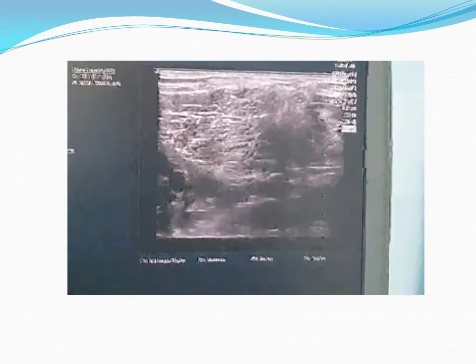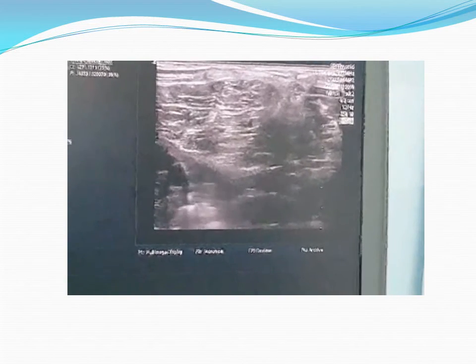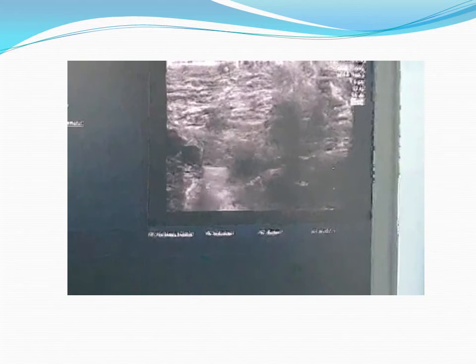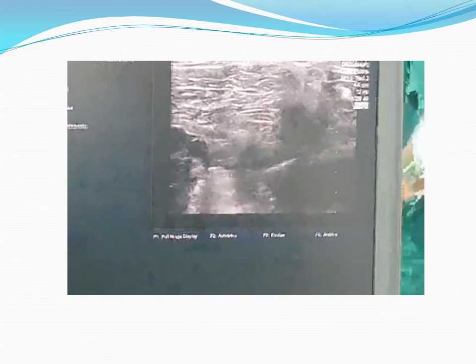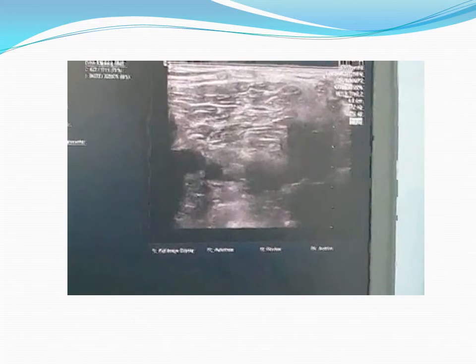Now against the posterior capsule, now inject. Injection now between the capsule. Any resistance? No. Okay. Give 5 ml. I will give one. Stop. Now I am redirecting the needle to go more laterally.